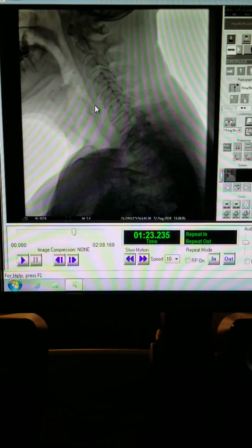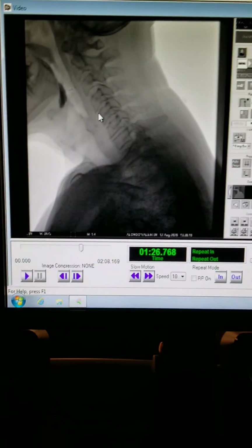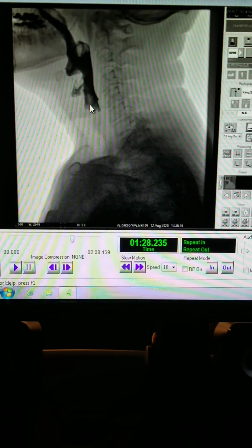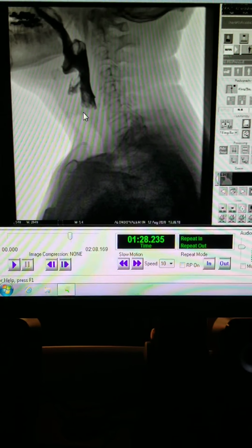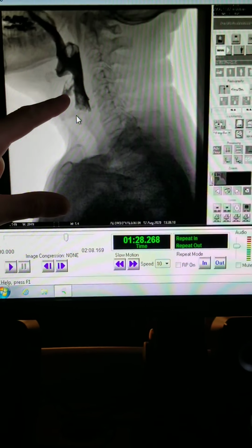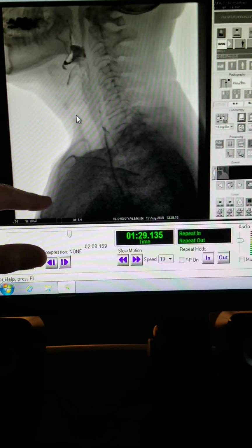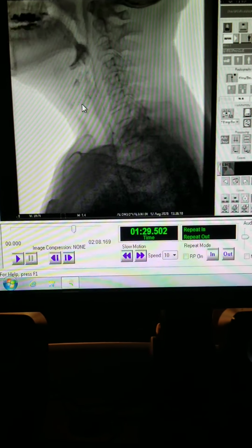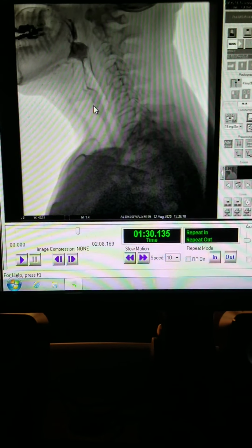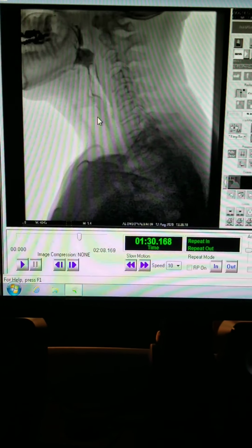Okay. This is the cookie, and we're going to see the most residue with this compared to anything else. So this technique that you have where you chew the food and then you flush it with liquids, you end up with a lot more deeper penetration and more significant penetration. So that's liquid trying to go the wrong way. And that's because you're just kind of flooding that chamber, right? Yep. But the whole time you do a really good job of keeping the airway protected.